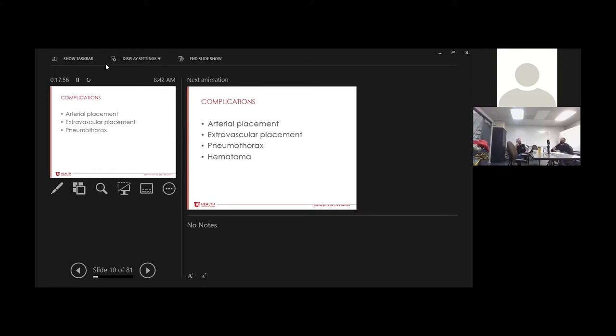Pneumothorax in the subclavian insertion. If you've ever watched a subclavian line by ultrasound, which is a slightly newer thing that they're doing, that was the traditional blind placement. Right. The needle tip is basically right at the pleura under the clavicle. It's very close. So you can cause pneumothorax, or hematoma in the coagulopathic patient, or even the non-coagulopathic. If you've got someone with multiple holes in these vessels, a couple holes in the carotid on their way to the IJ, that's a problem.